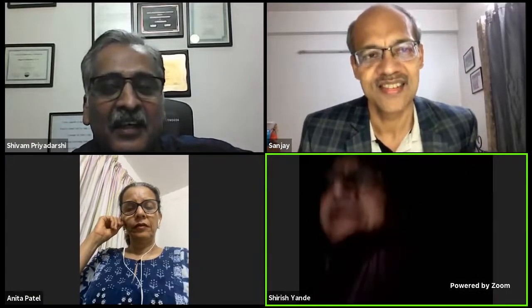Anyway, and that's one point, Shivam, that as Sanjay said, is the 3-step performance of urodynamic studies. The person who takes the history first generates urodynamic questions, and that has to be a clinician. It cannot be a technician. Okay. So we must understand what we are looking for.